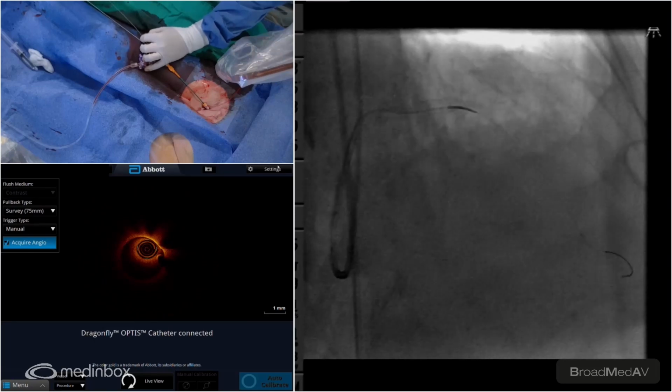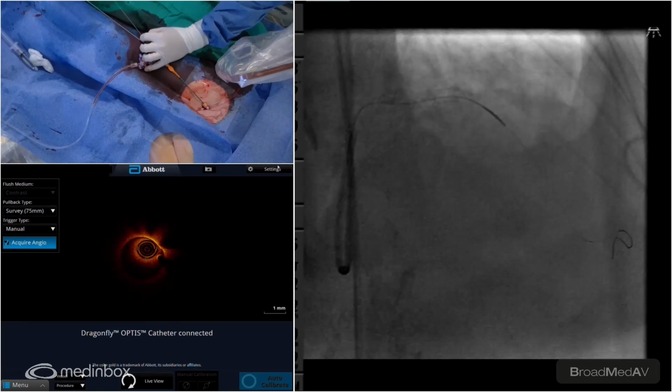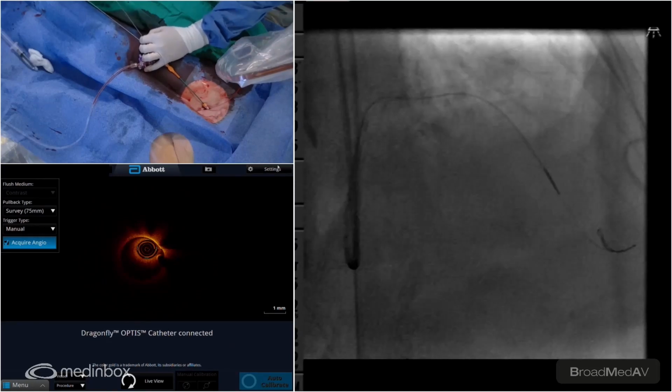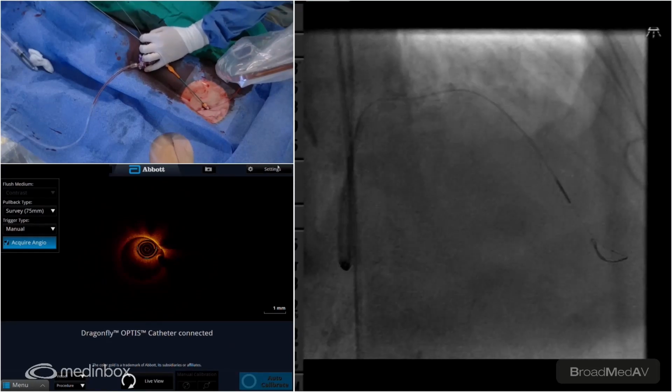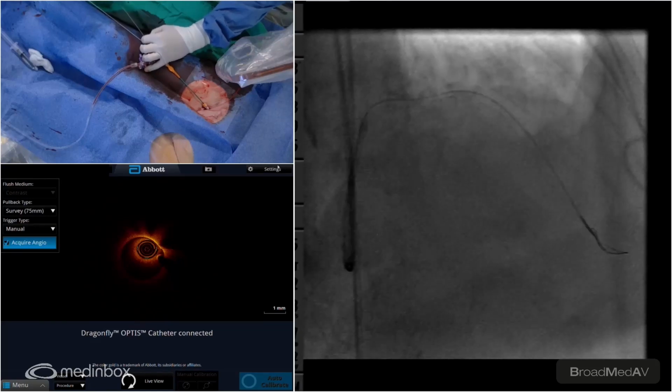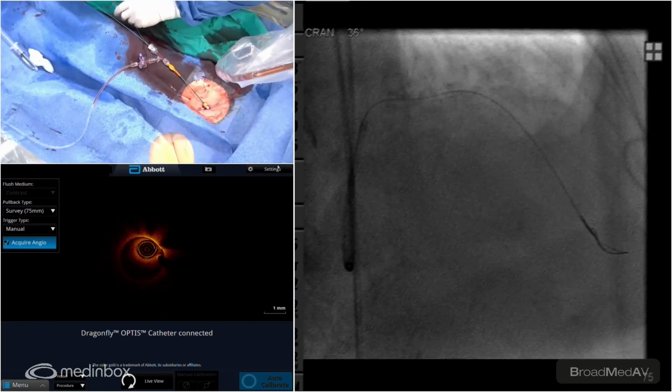Beautiful progress. And again, because I'm going to drop my rotor wire deep as much as possible, to give myself support, make sure I drop it somewhere that's nice and deep. I think that should be enough. Okay, can we get some flush on this thing? And I'll pull this out. Arjun can take that and just get some fresh for me. Perfect. BMW out.